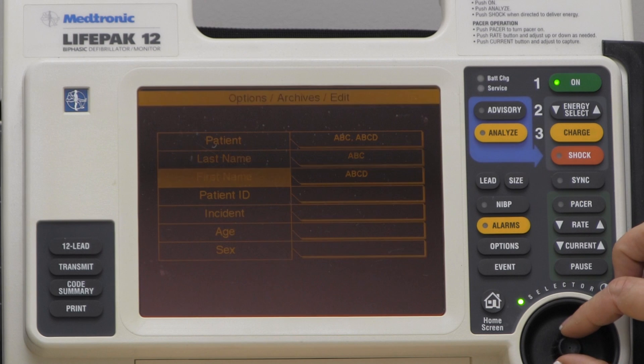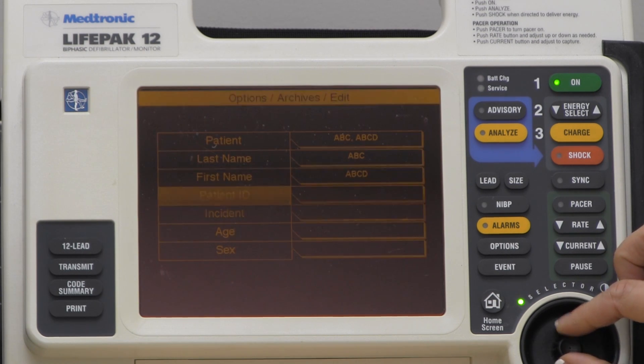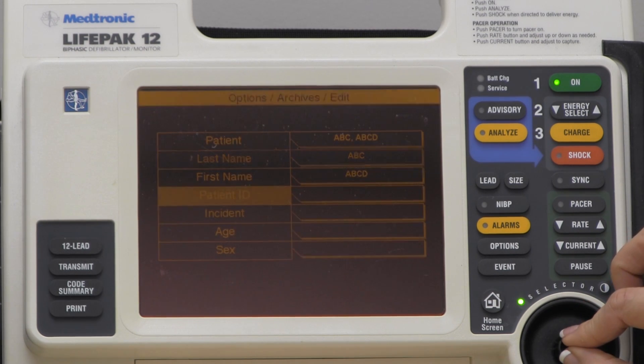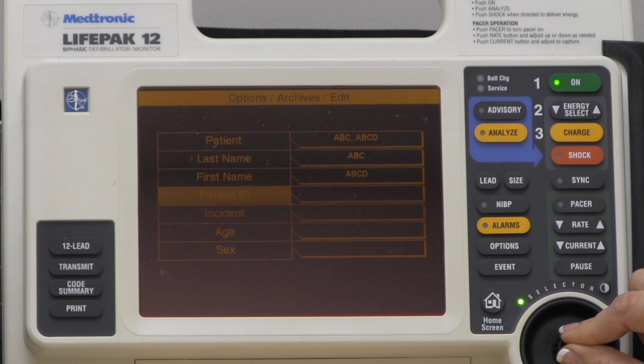If I have the birth date of the patient, I could go ahead and put it under Patient ID.